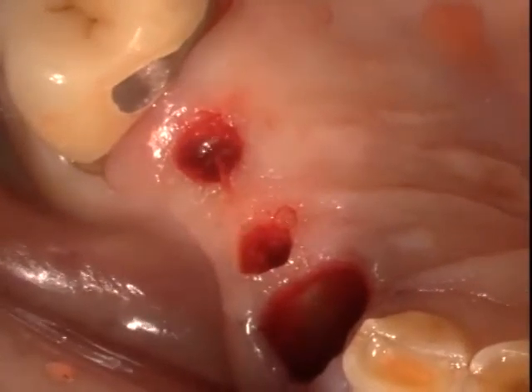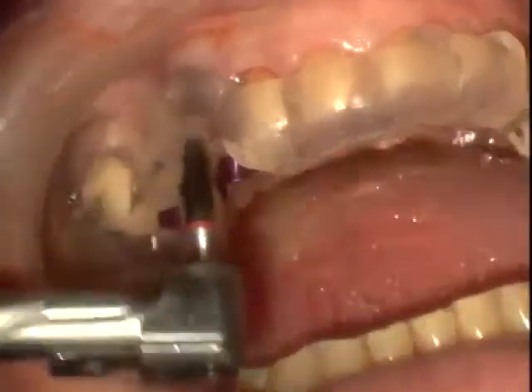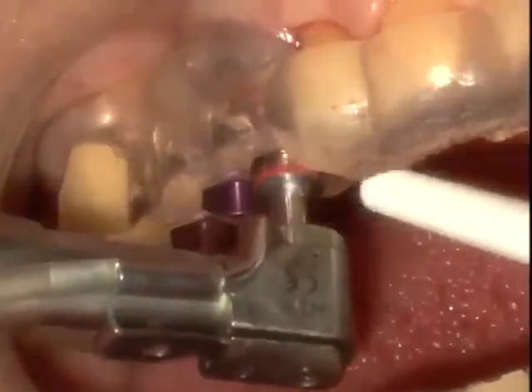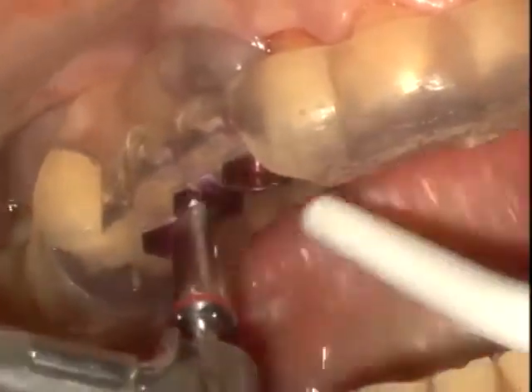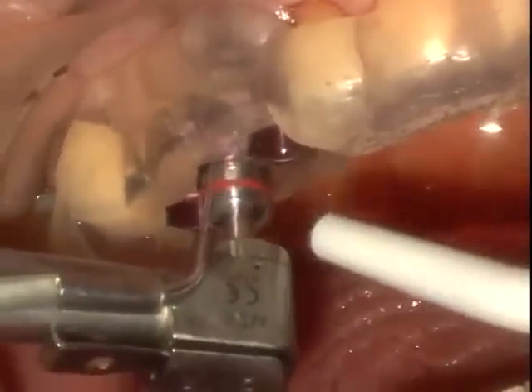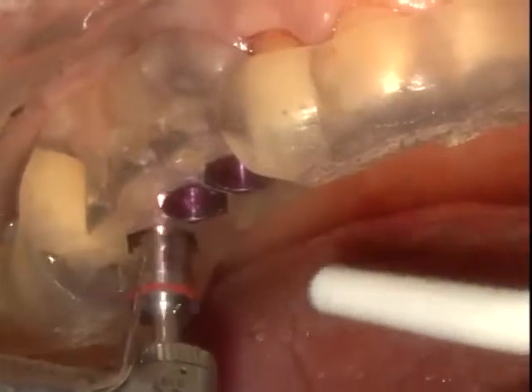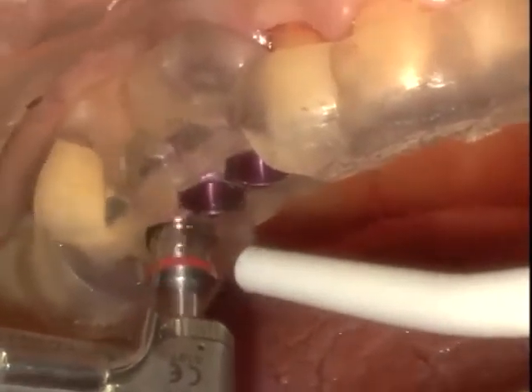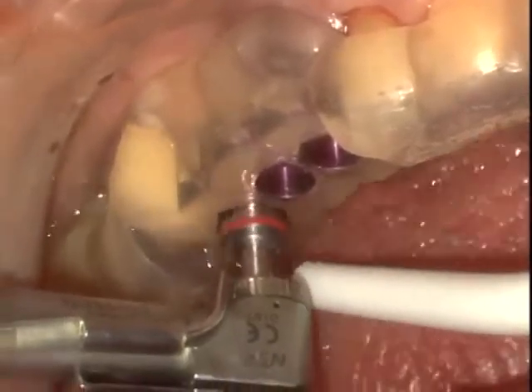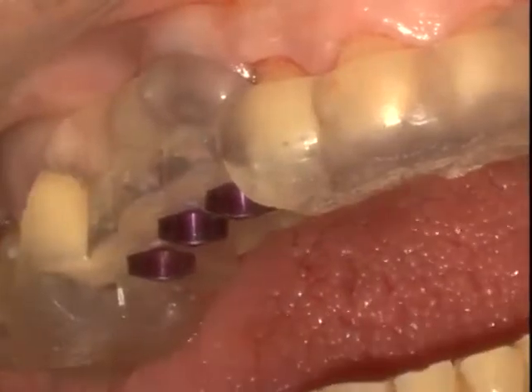This patient has medical complications, does not wish to have any regenerative procedures performed to augment the ridge. They just simply want teeth to replace the failed bridge. I can now utilize this same stent with an optimal fitting of the Expertise drills through the surgical guide holes. And this allows me to take it not only mesiodistally, buccolingually, but also to the precise depth.